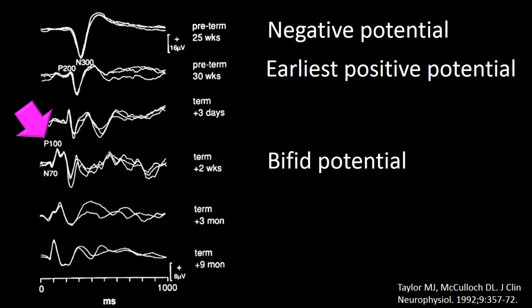The first of these two peaks is close to 100 milliseconds. That is, the latency of this first peak is about 100 milliseconds.